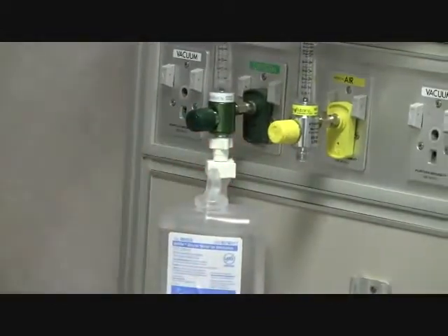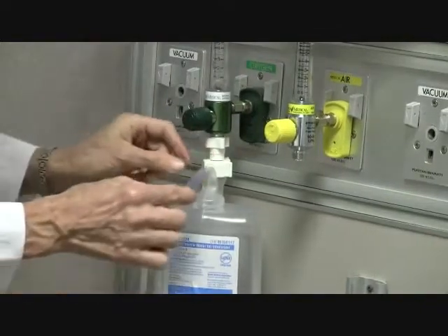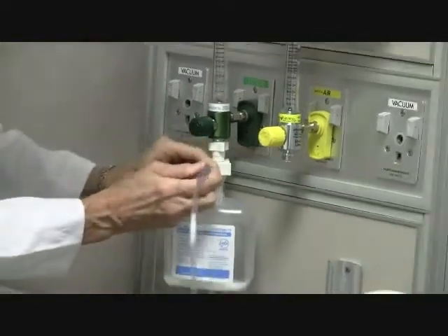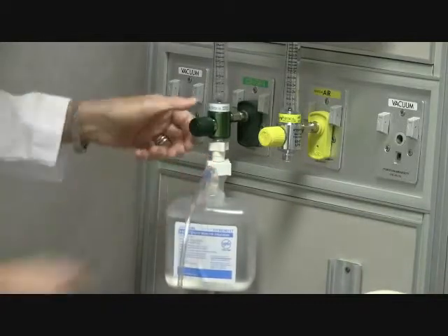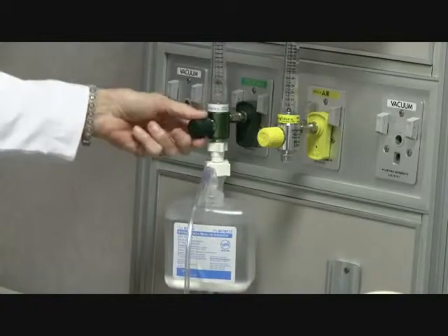You're going to get your nasal cannula, connect it. There's a port right here that you can connect it to. And then you're going to set your desired flow rate to your oxygen.